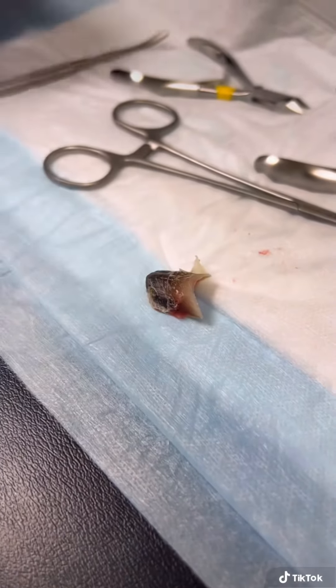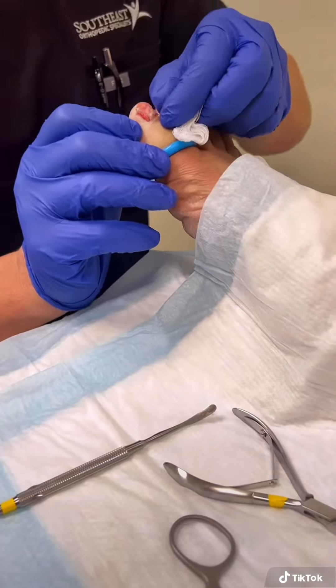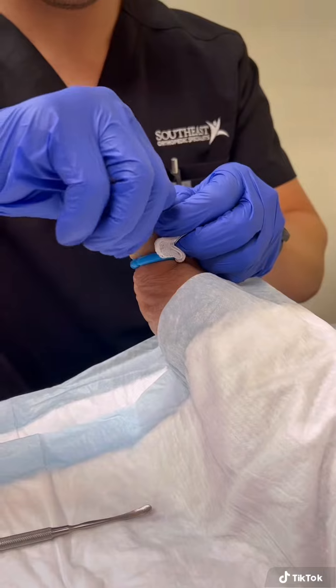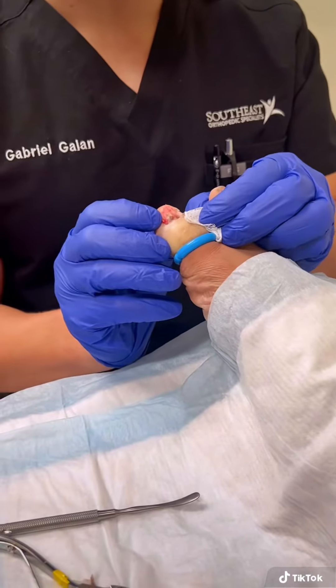It's a successful removal. Now we come back in and make sure there's nothing left. You can see we've got a little bit of excess skin that we just trimmed back. And there you have it — nice clean toe. All done.